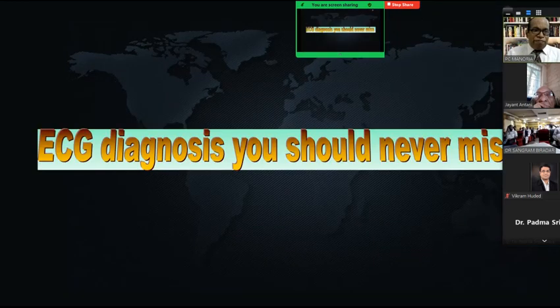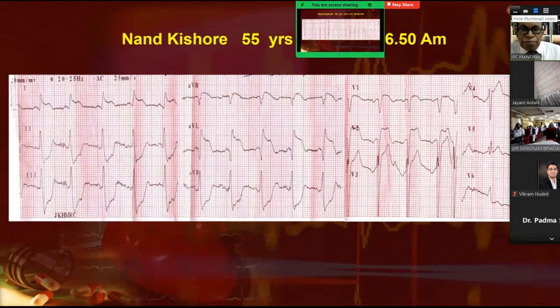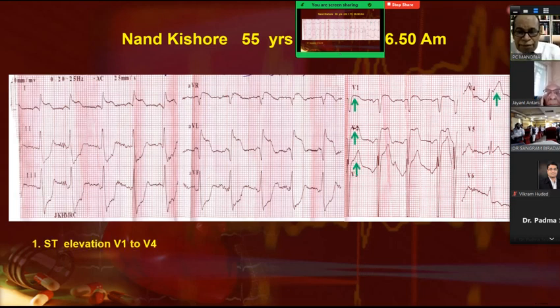The other thing which you must always try to recognize is this ECG, which you should never miss. Now, this is an electrocardiogram of a 55 year old male residing very near to our hospital. He develops severe chest pain. He immediately comes to the hospital, and this is the electrocardiogram sent on WhatsApp by the resident. Now, if you look very carefully, again the story is anterior infarction is very clear. You have ST segment elevation in V1, V2, V3, and so on. So no doubt that this is an LAD lesion.